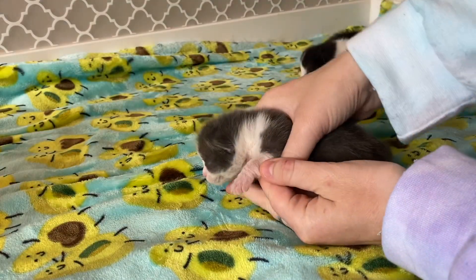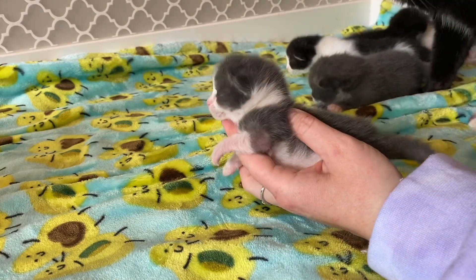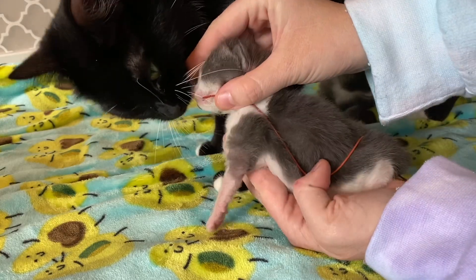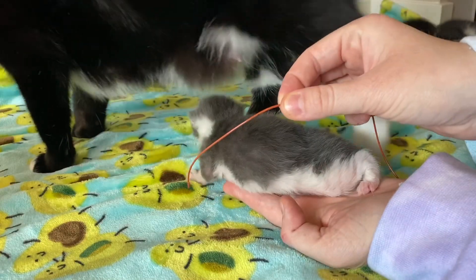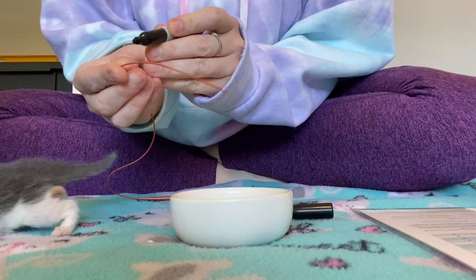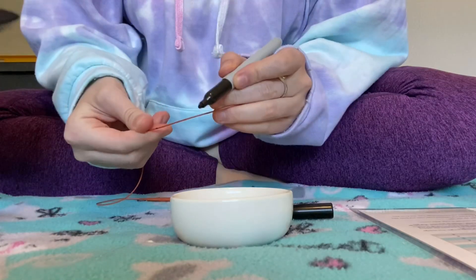Since this was a really difficult angle for me to get to the camera, I went ahead and made a clearer second video so that you could really see what I meant when I said I am going from the corner of the mouth down to that very last rib up against the kitten to measure where I want to put my permanent marker, because that permanent marker is going to tell me how far down the kitten's throat I need to be to be in the stomach.